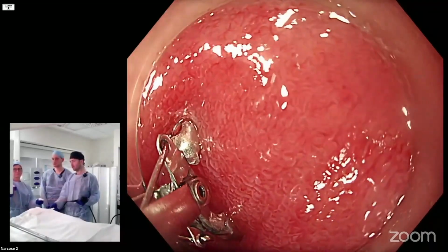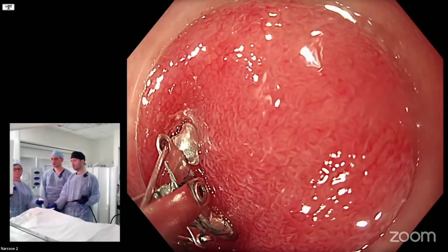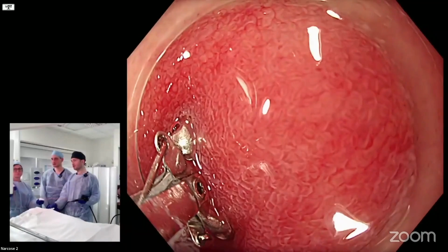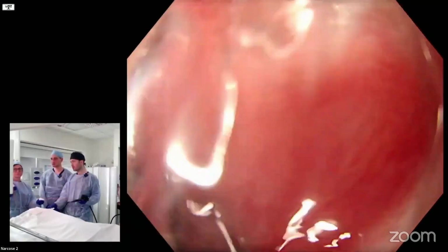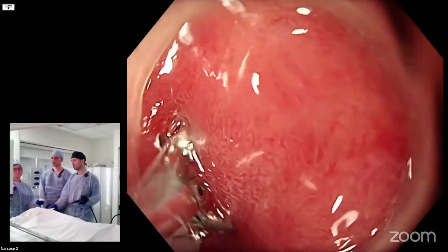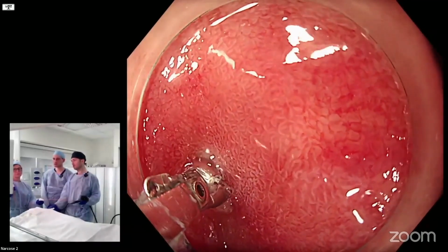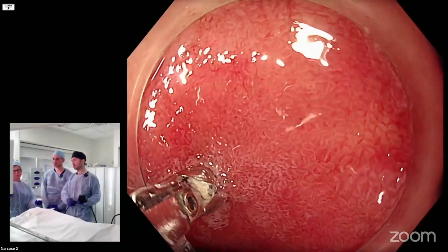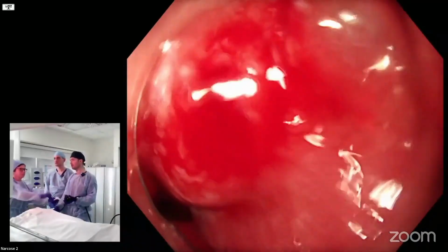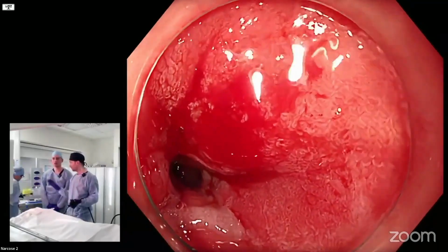I've used torque to turn into the mucosa. I'm doing some suctioning. Suction is not high because we want your experience of this course to be really nice. But if you suction, you really use torque to turn in. Then we can close the lumen a bit, then slowly close. Then we can definitely take a piece, right? This is one piece. And if that was a thing we needed to biopsy, then this is the only biopsy in this set. We put it in a pot.